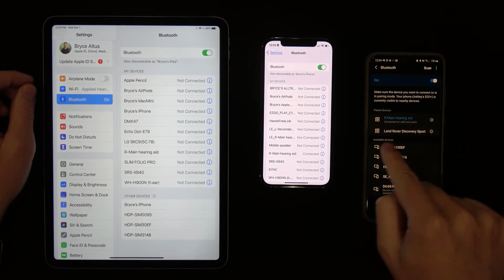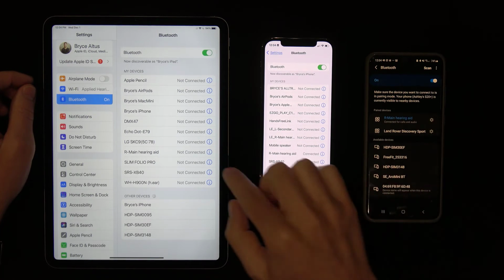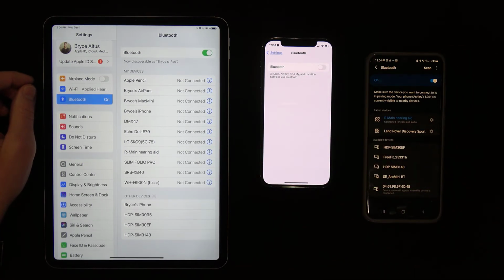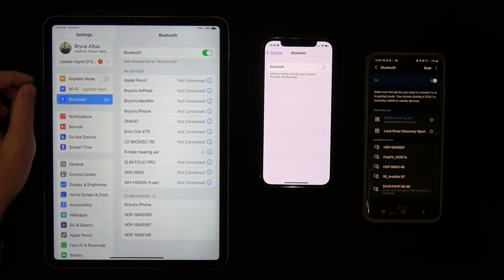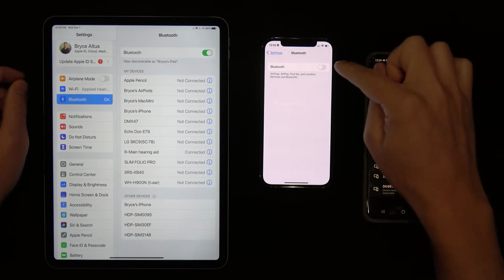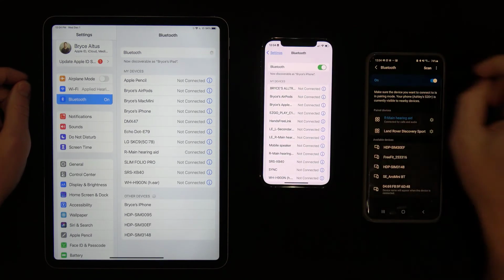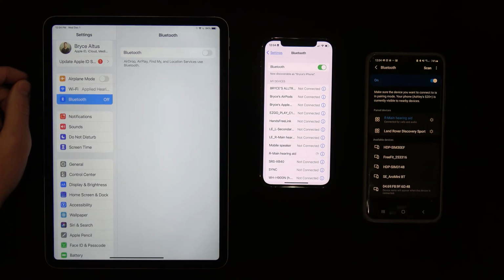One way that I find to be slightly quicker and easier is to completely turn Bluetooth off on the device you no longer wish to use. Then tap on the name of the hearing aid in the other device's Bluetooth menu that you want to start streaming from. This will still keep the pairing saved to your Bluetooth devices just like the other method, but you'll need to make sure that you turn Bluetooth back on on the device you just turned it off on if you want to start using that device again in the future. Thus, you would have to then turn Bluetooth off on the Android phone.